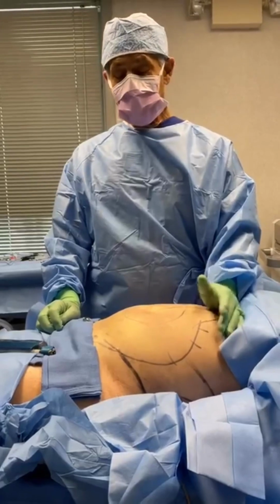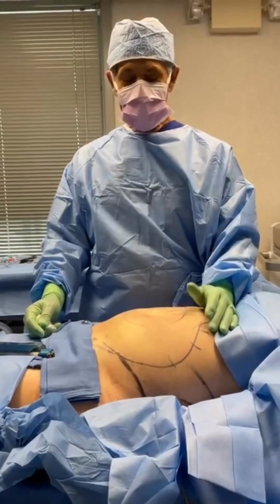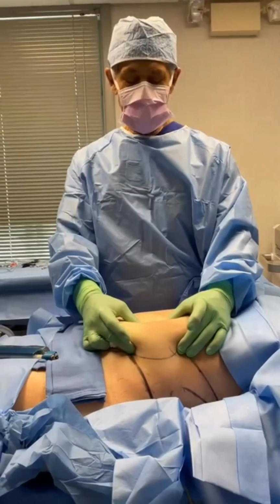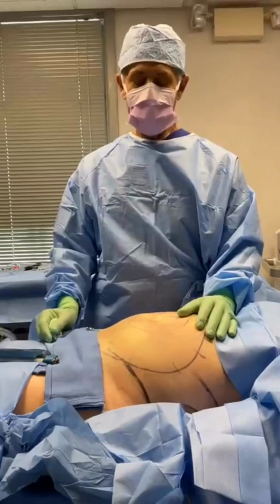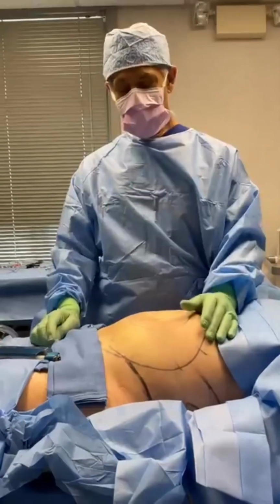And also, and understandably, many people would say, okay, take every little drop of fat out that you can. You don't really want to do that. I mean, right now, I can grasp this amount of skin and fat and a little tumescent fluid. Later on, you'll find that it's quite flattened out. You always want to leave a little bit of layer of fat everywhere under the skin so that things remain smooth.